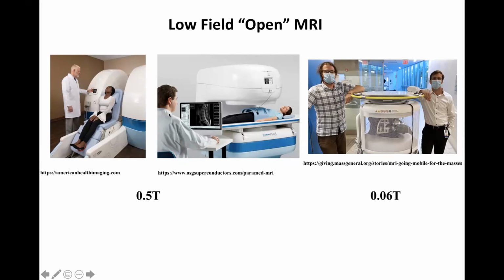Basically, you can have it in this orientation where you can gain access to the patient if you're doing some kind of intervention, and the patient doesn't feel at all claustrophobic here. And then another way of setting the system up, with exactly the same system, you rotate it and then the patient can move in and do positioning such that their spine is actually under weight, right?